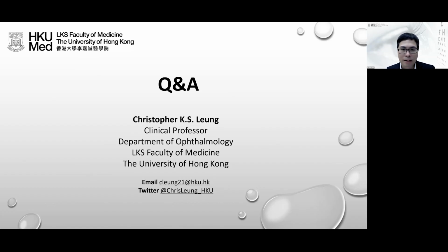I hope my lecture is practical. I understand a lot of you may not be able to get the correct answer. It's not easy, but I hope you can get more time to practice reading OCT, to practice reading printouts, and I'm sure you get more confident when you use OCT more often. I would like to take the last 5 to 10 minutes to answer some questions posted in the Q&A.